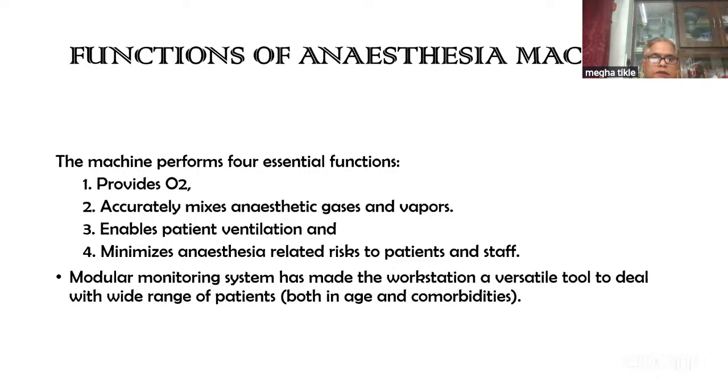Now, modular anesthesia system has made workstation a versatile tool to deal with wide range of patients, both in terms of age and in terms of comorbidity. So when we add, say, non-invasive cardiac output monitoring, we can use it for patients who have very less cardiac output or at a high risk for having intraoperative cardiac failure. So we can monitor their function, we can decide what drugs need to be used for them and when that drug needs to be used for them.